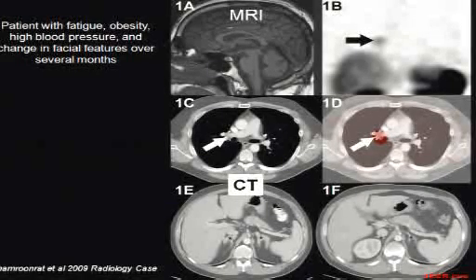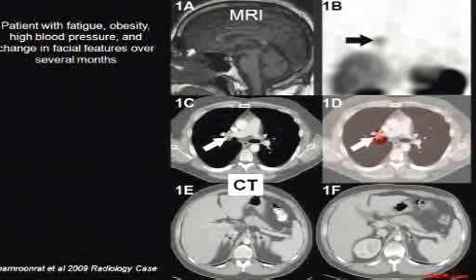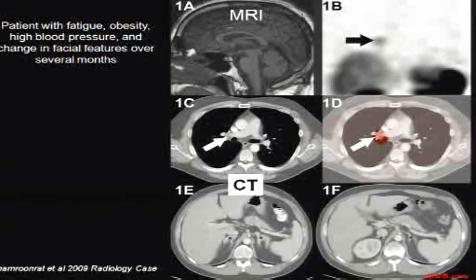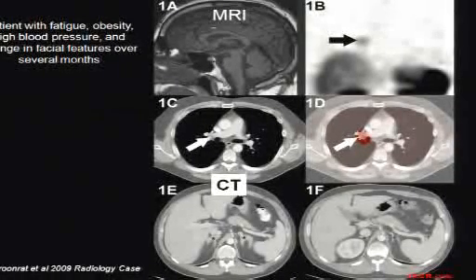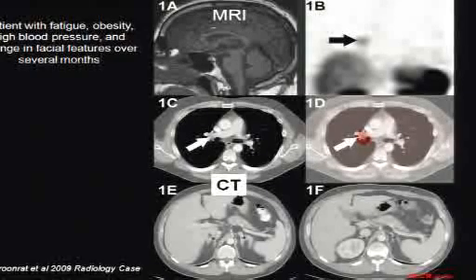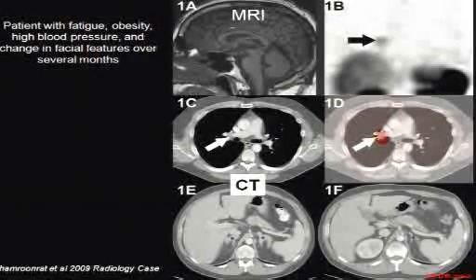The MRI ruled out the possibility that this hormone was coming from the pituitary gland, which would be candidate number 1 for that possibility. We now have done a whole body CT looking elsewhere for perhaps a tumor in the rest of the body that would be producing this hormone. And now we've found perhaps a lymph node, but maybe not a lymph node, maybe a tumor, a very tiny tumor, and very enlarged adrenal glands, which certainly could cause the increase in hormones and these symptoms.